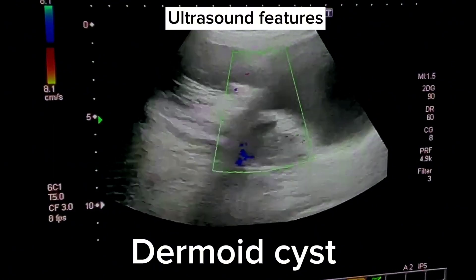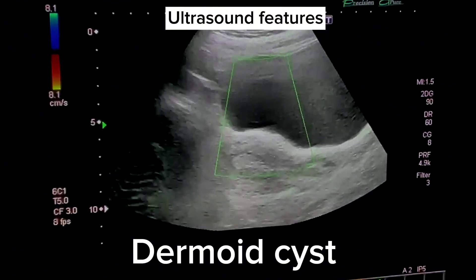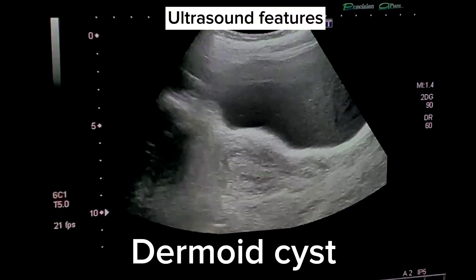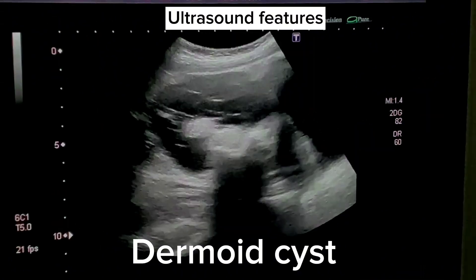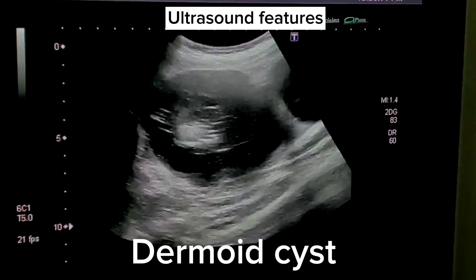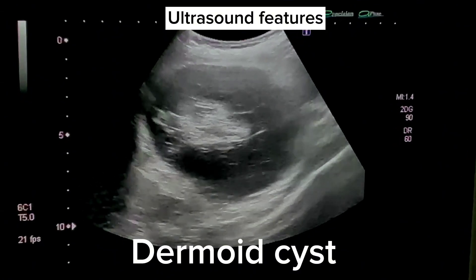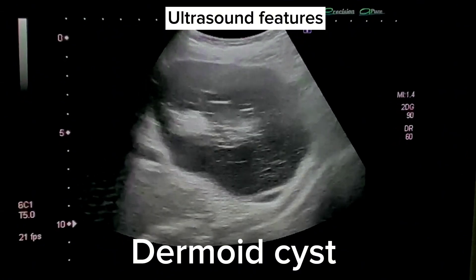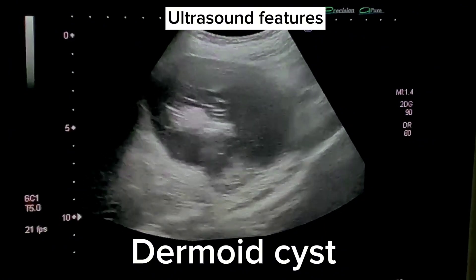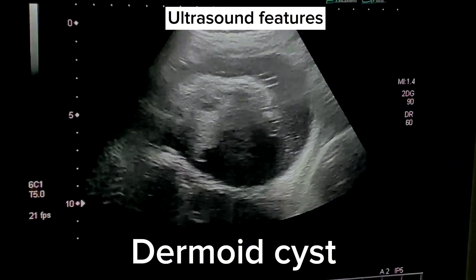Internal echogenic strands or floating balls are also noticed, representing hair and sebum, which can appear as echogenic strands within the cyst. It is normally a well-defined, thin-walled cyst, usually well-circumscribed unless complications like rupture or infection have occurred.